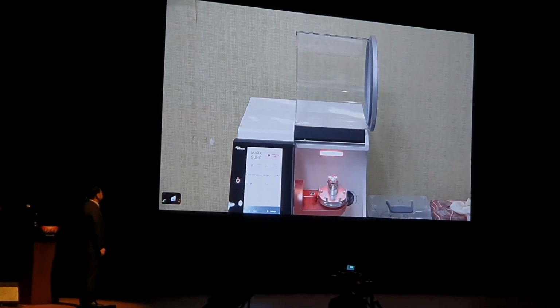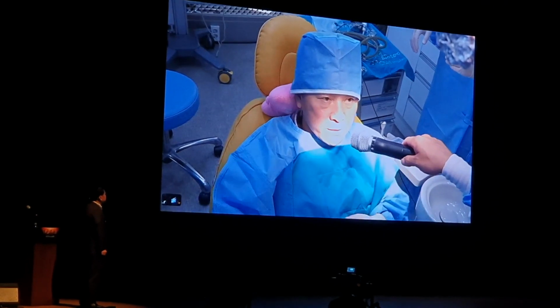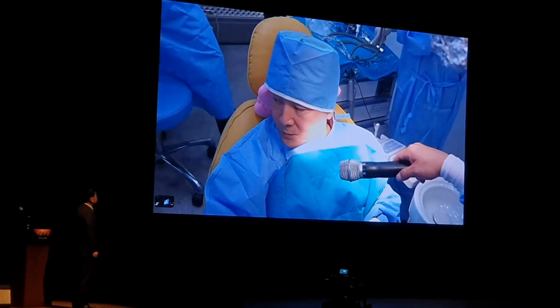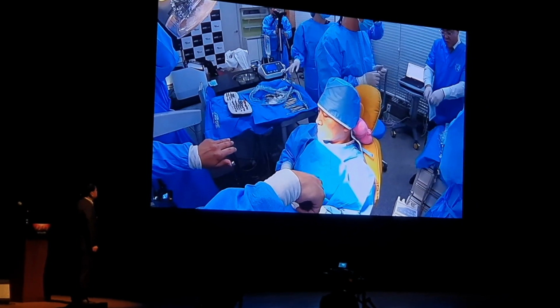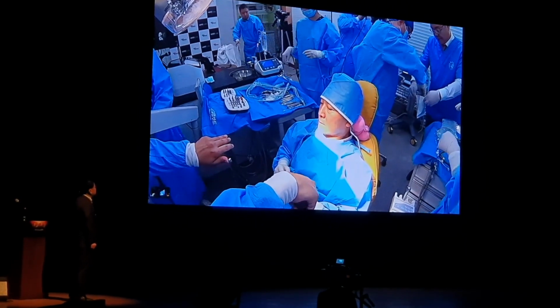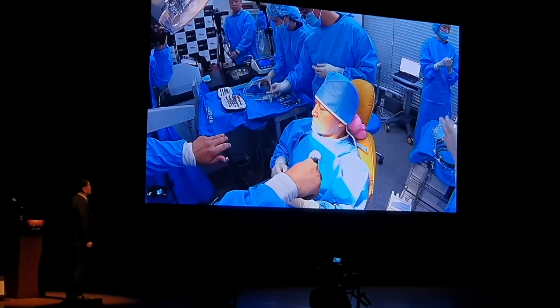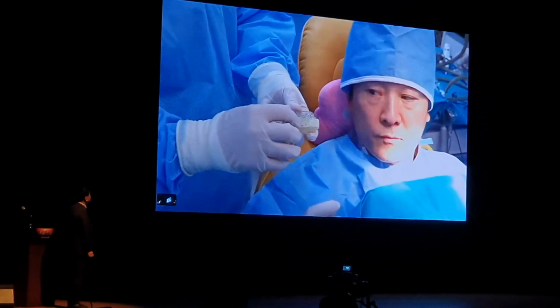Now when the guide is here, I'll test the fitting first intraorally, then move on from there. Is the guide ready? Yes, it is. So please hand it over to me. They are taking out the guide from the antiseptic solution. Bring it over here. Cleansing the residual solution with saline, and then relocating it inside the mouth.